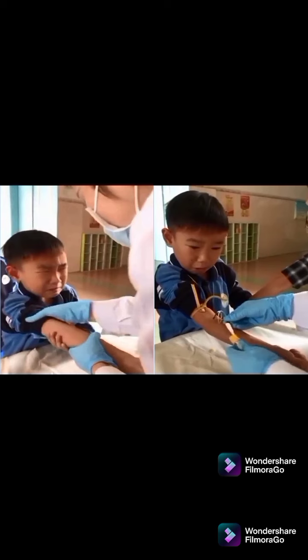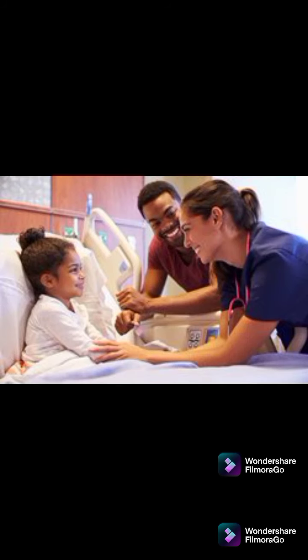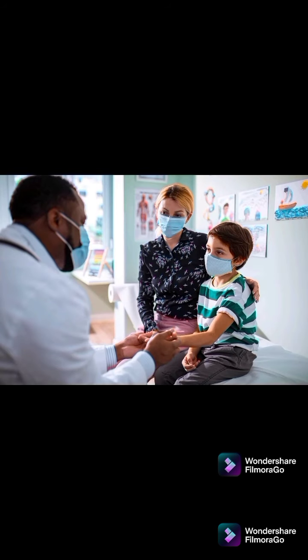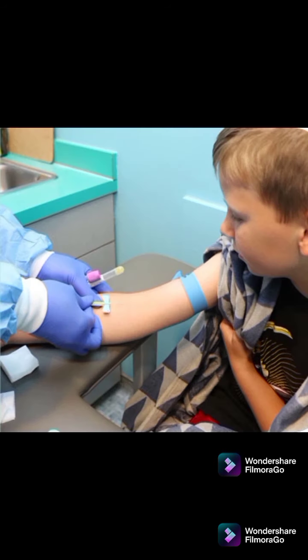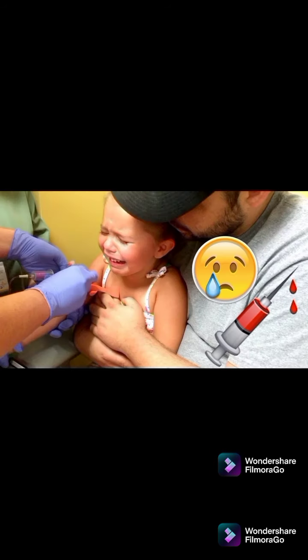Pain can be minimized by including the use of EMLA, a mixture of local anesthetics, or oral sucrose and pacifiers for infants and toddlers. As stated earlier, 23-gauge butterfly needles are preferred for children and attempts should be made to collect the minimum amount of blood required for testing due to the small blood volume of the child. Follow previous collection steps as stated before.